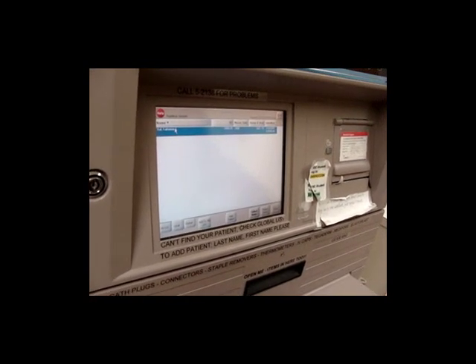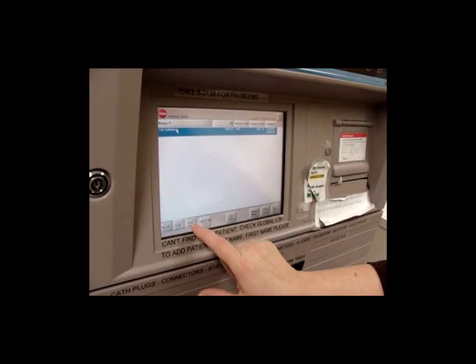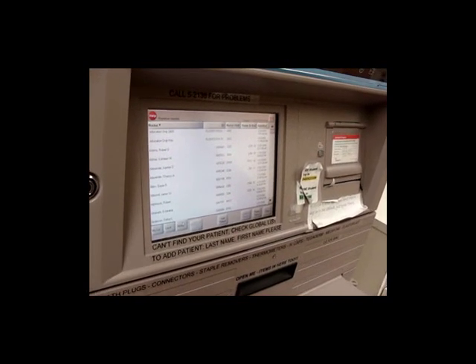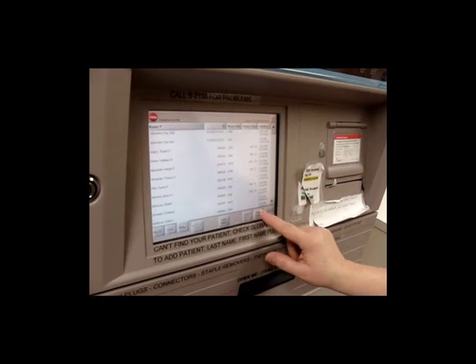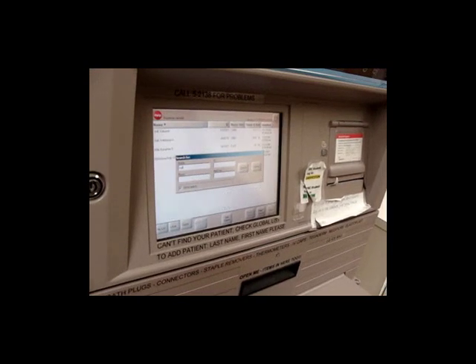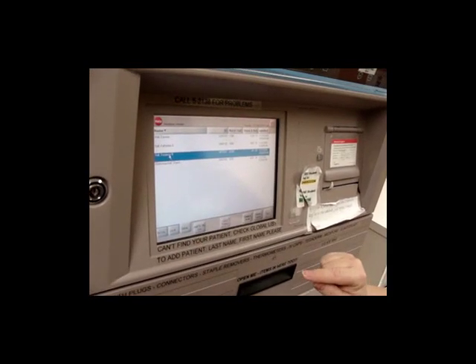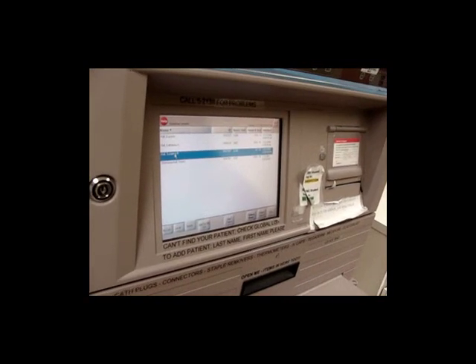So if I can't find my patient by searching the local list, what do I do? I can hit the Global tab, which is right here, and it will allow you to see all patients in the house. Many times a transferred patient won't yet be on your local screen, but it may be on the other unit. So I can hit Patient Search again and look up that patient, and I see all patients that are on that unit, and perhaps I'm looking for this patient who is going to transfer in. So I've now selected her, and I can use her to get items for this unit.